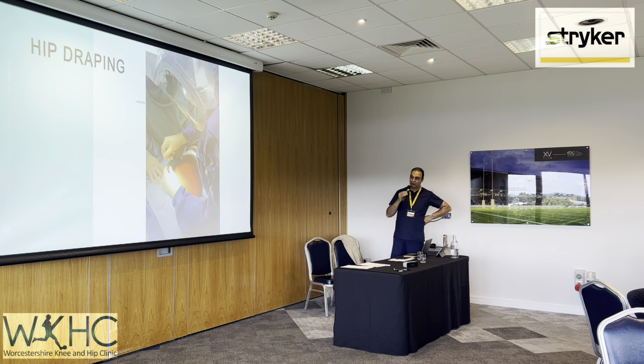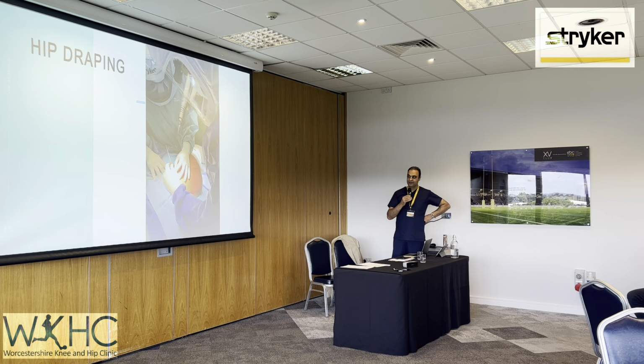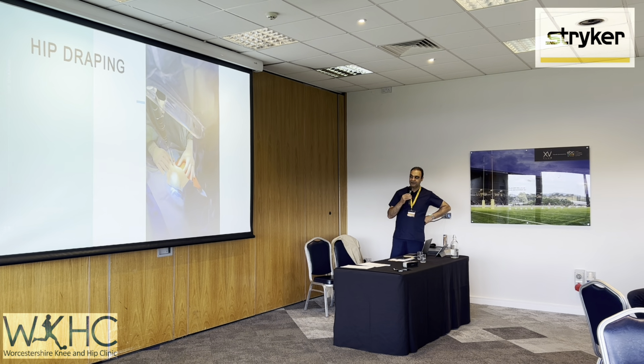And this is really important because you need to make sure that you're on the bone. Because if you're not on the bone, that pin will go either into the abdomen or it will go outside the pelvis. And you can tell by feeling if you're in bone. So we put the first pin in, and then we feel the second pin and bounce it up and down on the actual iliac crest to make sure that it's on bone.